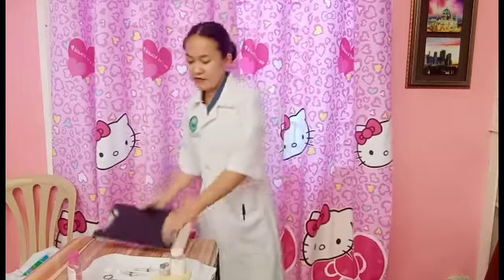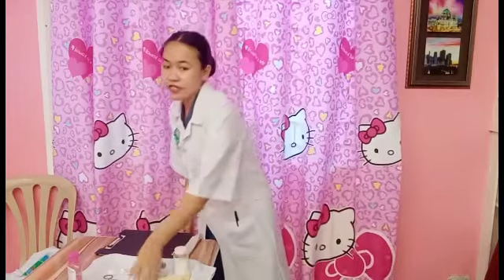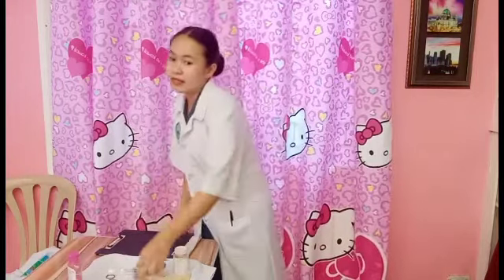Next is to assemble equipment. This is to maximize time and avoid delay. So the equipment that we need are the MAR, or computer printout MAR, or medication administration record, vial or ampule of the correct sterile medication, appropriate syringe and needle, antiseptic swab, dry sterile gauze, and clean gloves.